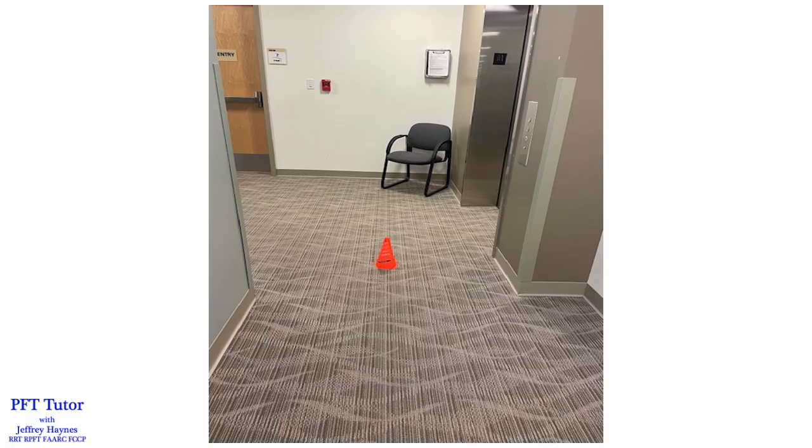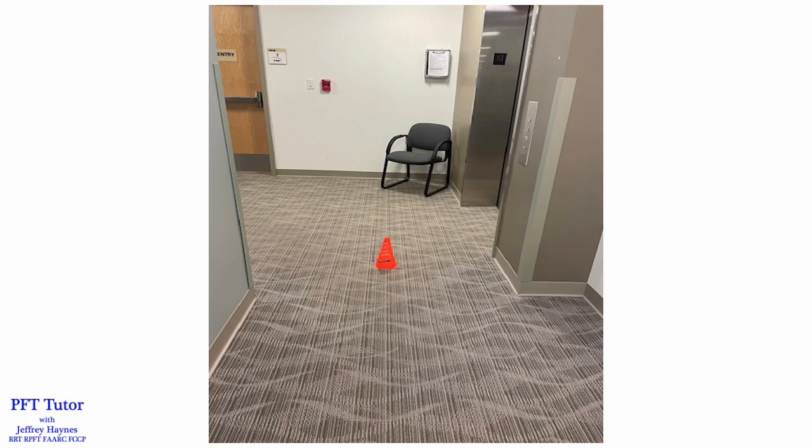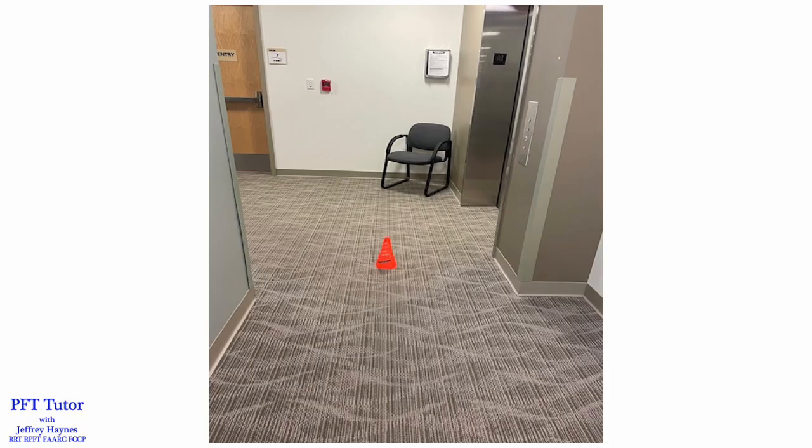For safety reasons, it's a good idea to position chairs around the course in case the patient experiences severe symptoms and needs to sit. We have a chair on each end of the course and one at the midpoint. Patients rarely need to use them, but it creates a safer environment for testing.